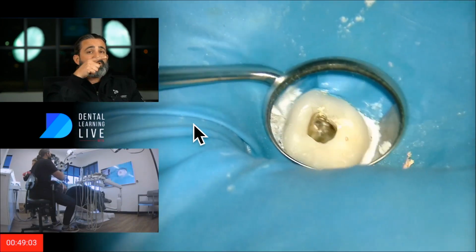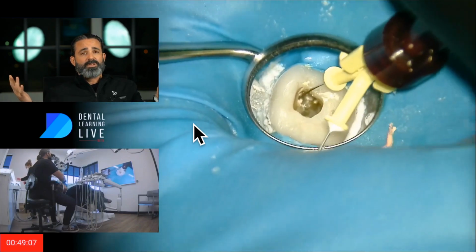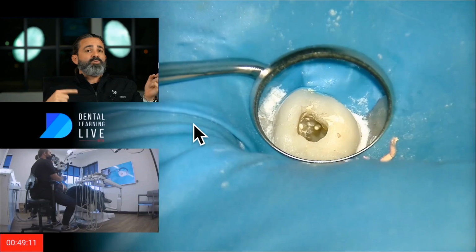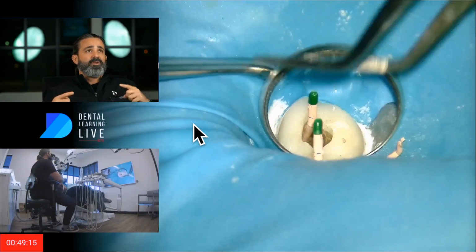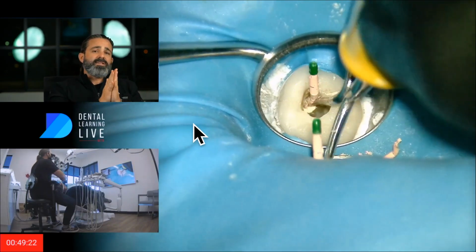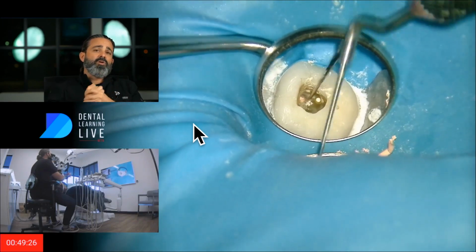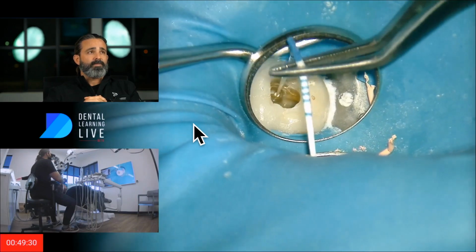So what just happened is I pulled the cone. I'm sure we've all done that before. If I pull the cone, I'm going to reapply my sealer and do it again, but I usually will go up a half size. So I was at a 30, now I'm at a 35. Why do I do that? Well, that's my protocol, because why did it pull? If I didn't create friction with the down pack and heat, then I'm going to go up in size to try to generate a little bit more. And that's what I did there and why I did it.